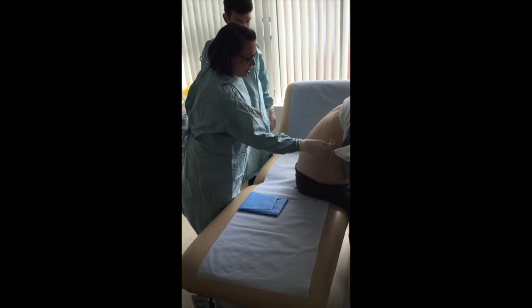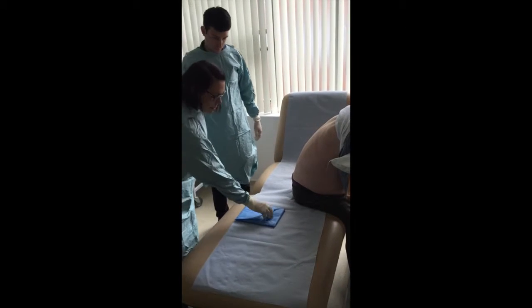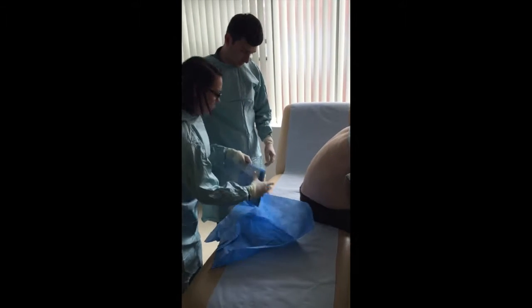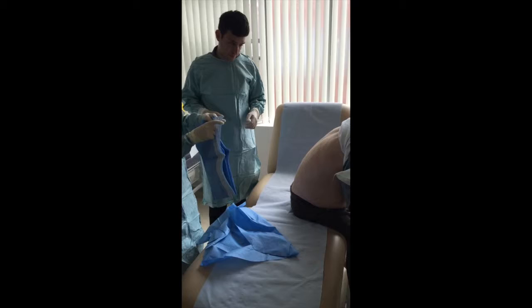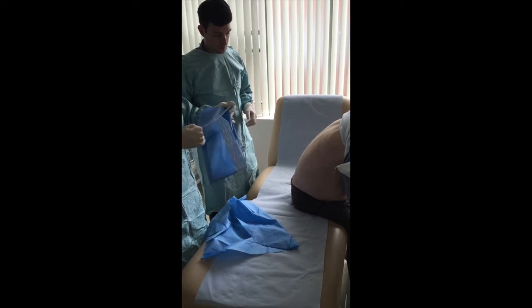I'm just going to clean around that. Then what we're going to do is pop a drape on. Let's just pop that on. And then if you just put it on straight at the bottom, it's got a sticky part on it. Okay.